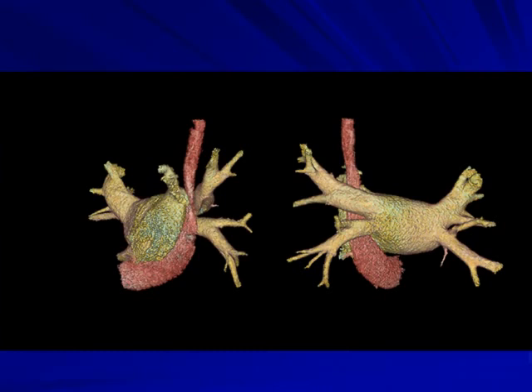Here's a typical example. This is a patient, AP and PA views, same patient, who has fairly normal pulmonary venous anatomy. We've got this branch. In this particular case, this left-sided SVC is in concert with the right-sided SVC. I know that because this isn't a terribly large vein. It can't account for both arms and the head, so it's only draining the left arm.